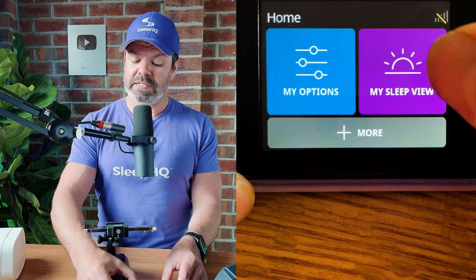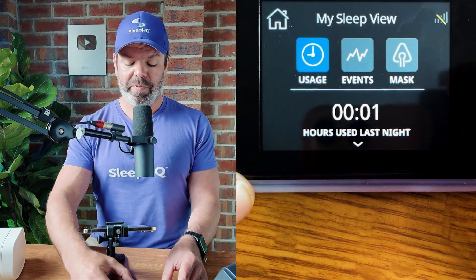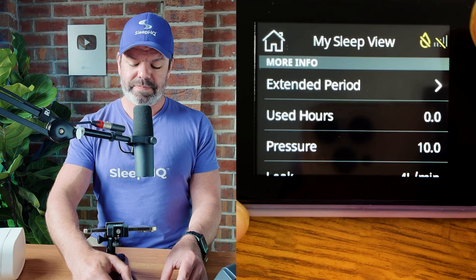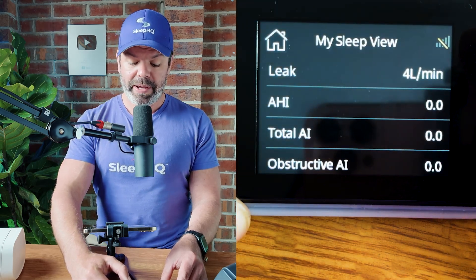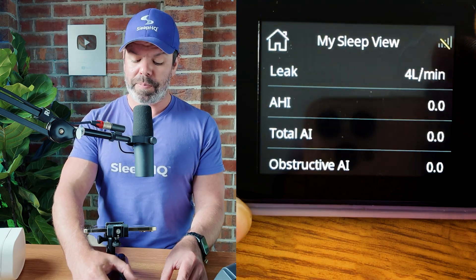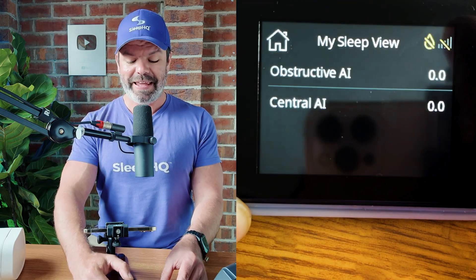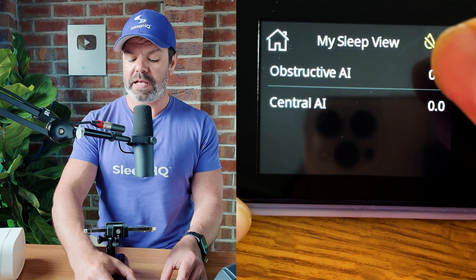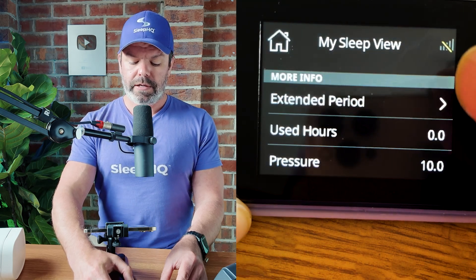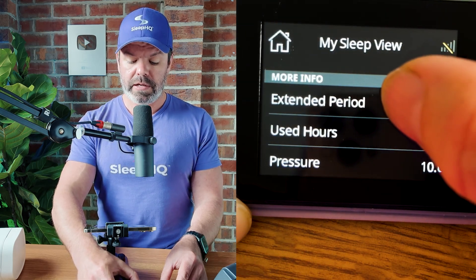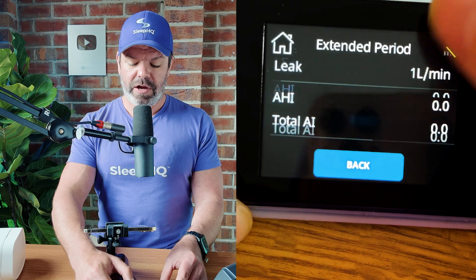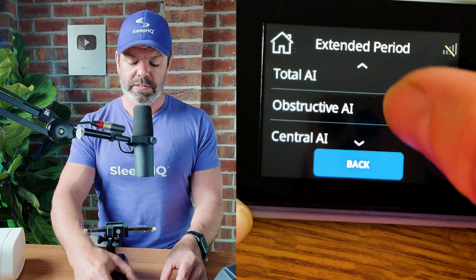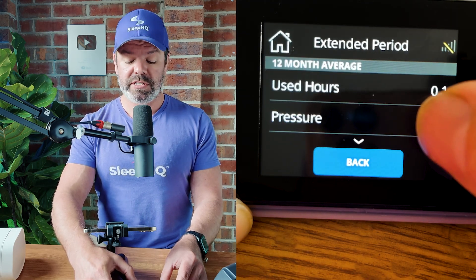Now when I tap my Sleep View — a lot more information. We've got used hours, pressure information, leak information, apnea-hypopnea index, total apnea index, obstructive apnea index, central apnea index. We can also tap this extended period menu option and get even more information over a larger time frame — 12 month averages.